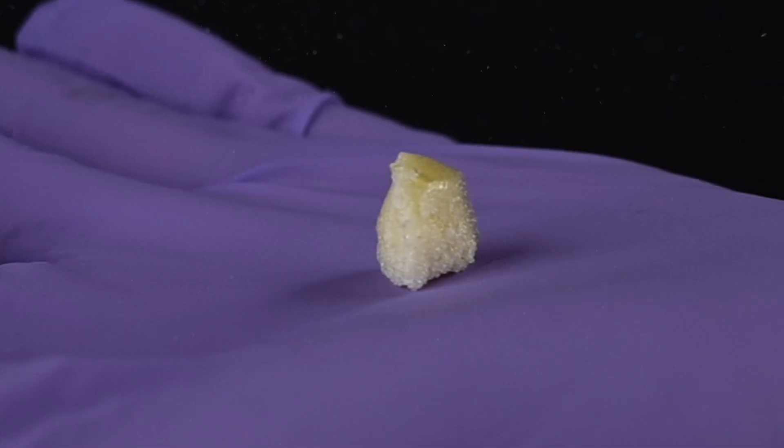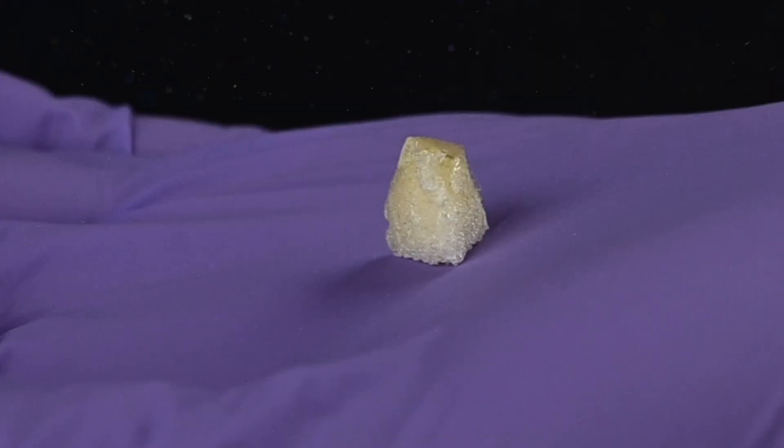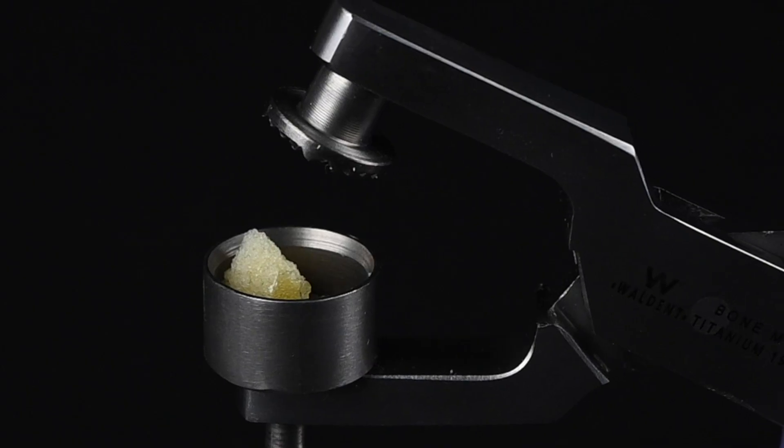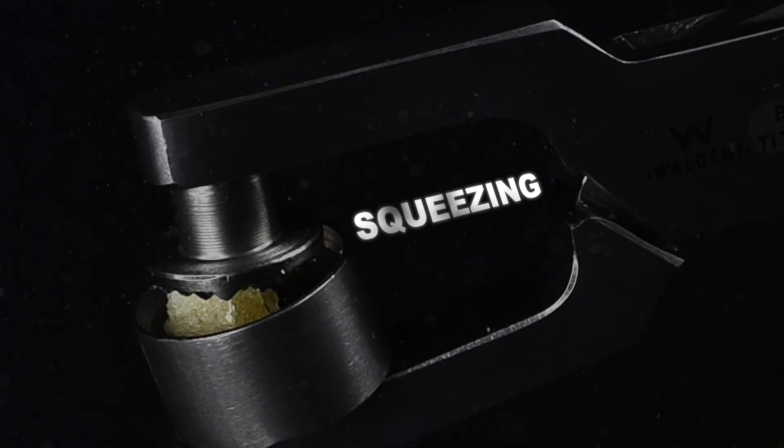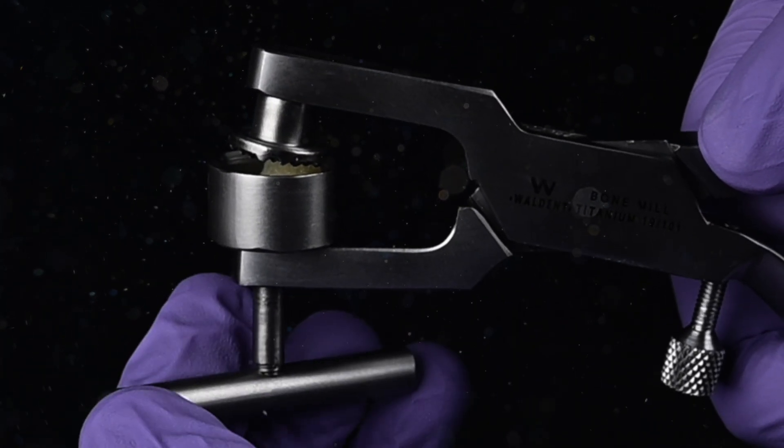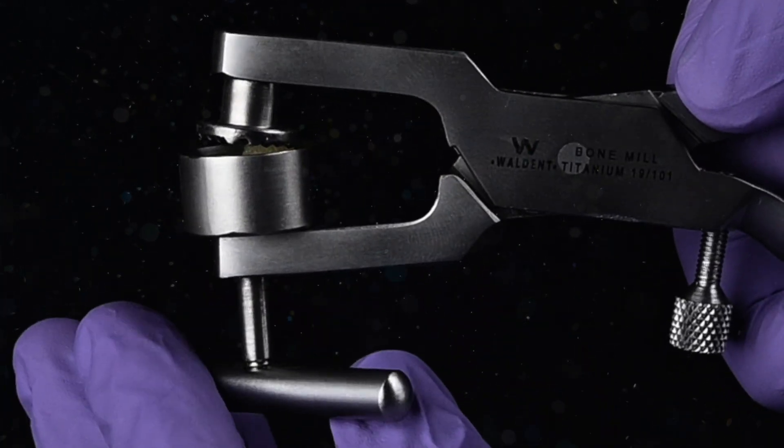Directions to use: To prepare harvested bone, simply place it in the Walden Bone Mill plier well and close the housing by squeezing the handle. Turn the T-handle to break the bone into small pieces using the textured titanium surfaces.